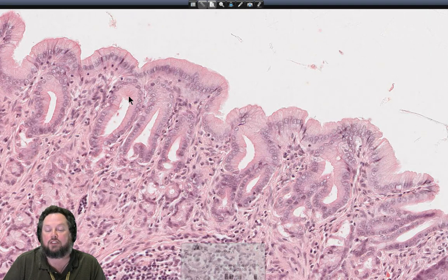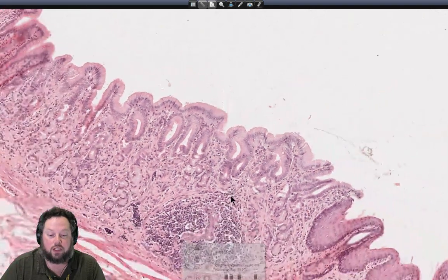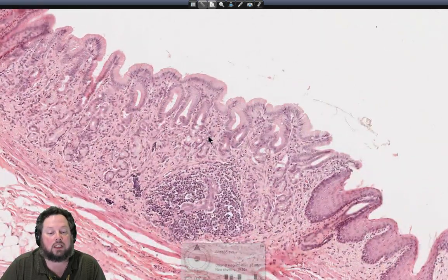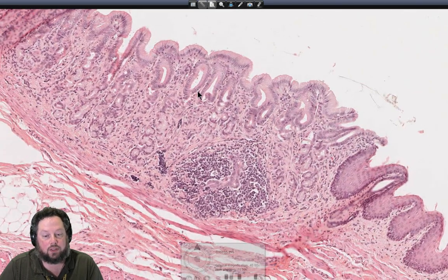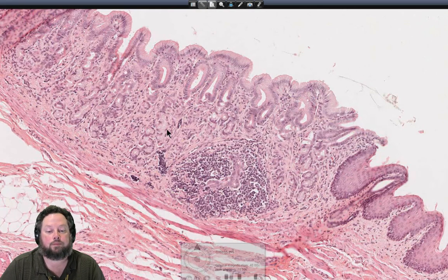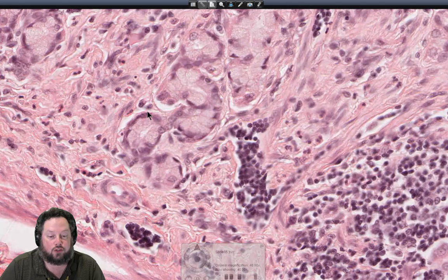So histologically, we recognize 3 regions of the stomach. The first region, which is this small region at the junction here, is known as the cardiac region of the stomach, and it's characterized by having these gastric pits, which are about 40% of the depth of the entire mucosa, and they're also characterized by having these mucus secreting glands, and that's what these are here. So these are known as cardiac gastric glands, or just cardiac glands, and they're mucus secreting.